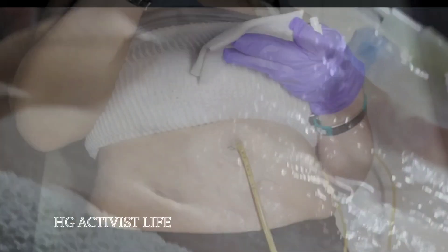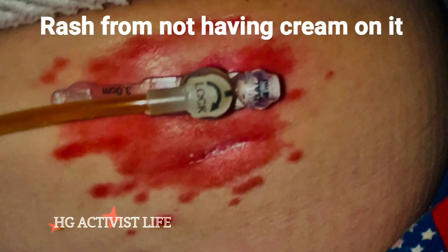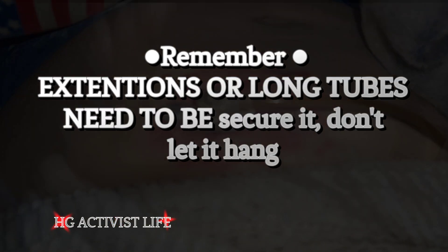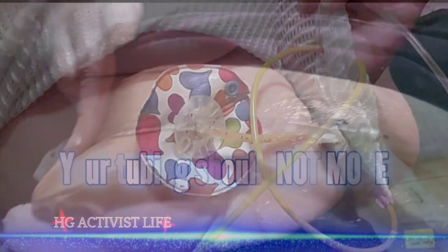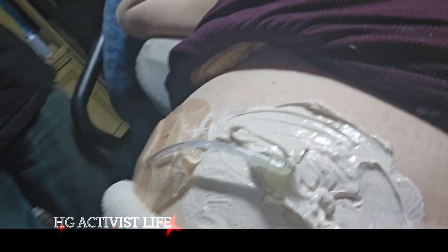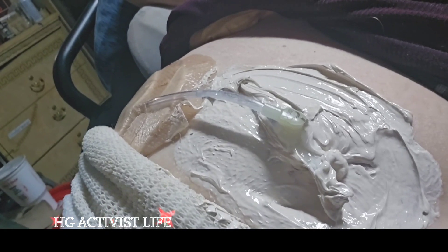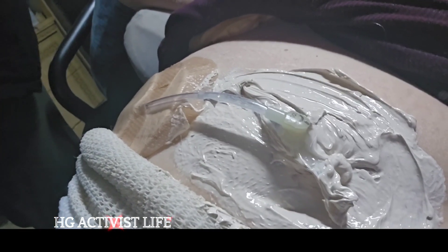Do not want to leave your extensions dangling — you need to have them stable where they're not moving, otherwise you get granulation tissue and your stomach will get a rash and can bleed.